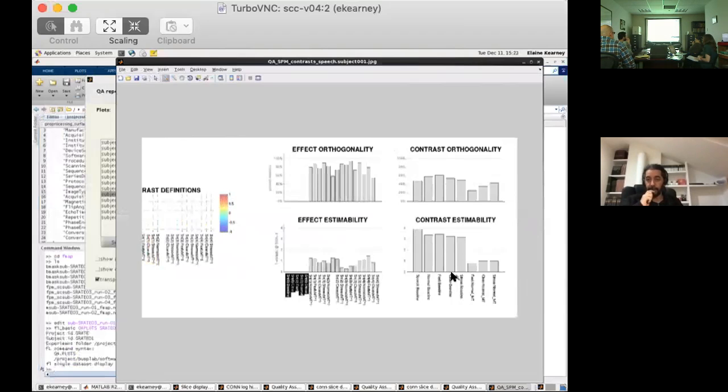So for these plots, it's kind of like estimabilities, you want to be above 1 generally? Yeah, there is not an absolute threshold, but yes, 1 is a relatively minimal value that you would expect to see for something like this. Okay. Because signal to noise ratio of 1 is relatively low, right? Because the residual, after you account for everything, there is still residual noise, which is anything like physiological noise that hasn't been accounted for, and there are motion effects and many other effects. But if your effect size is of the same size as the noise, basically a signal to noise ratio of 1, that is a very low effect size.